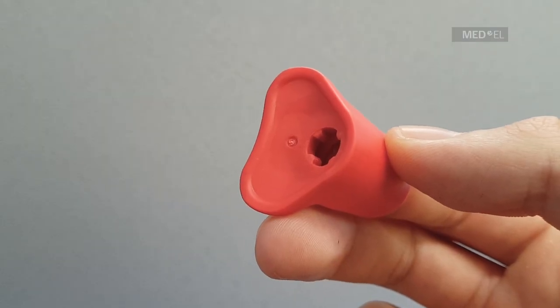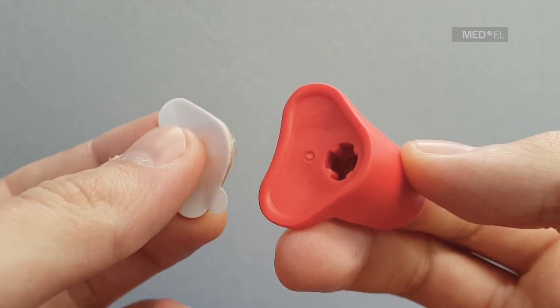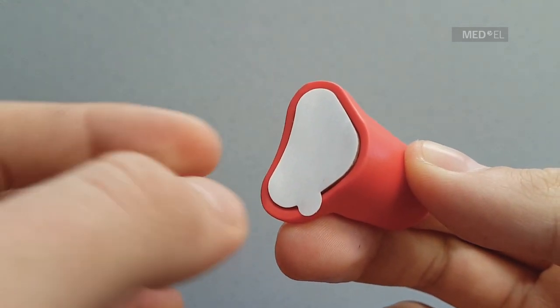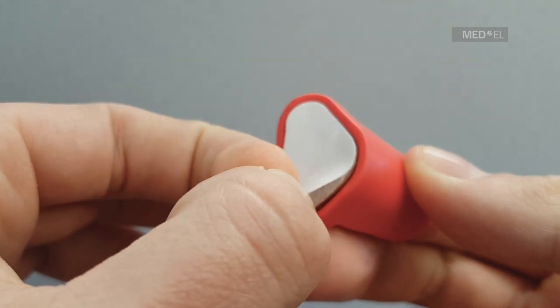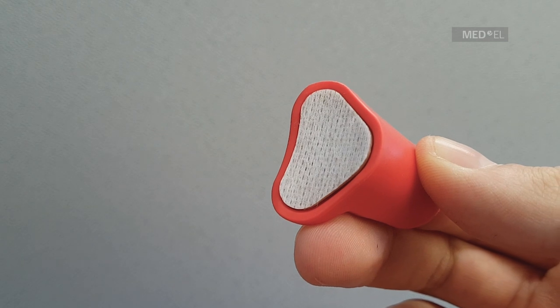You can use the positioning tool to help you correctly position the adhesive adapter. Place the adapter in the tool and remove the protective film. Do not touch the adhesive surface. If you do accidentally touch it, or if you put the adapter in the wrong place on the skin, simply try again with a new one.